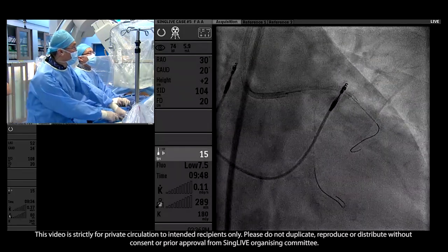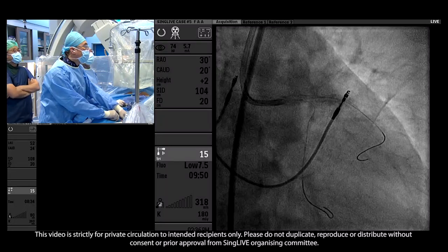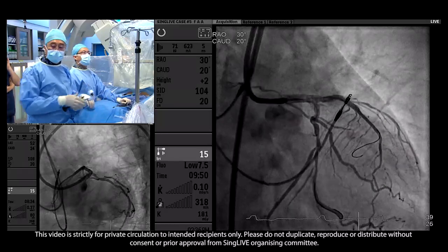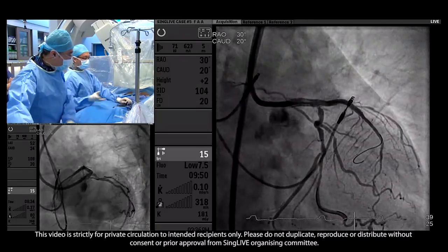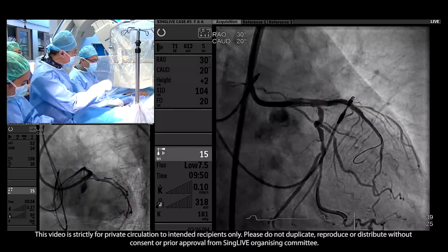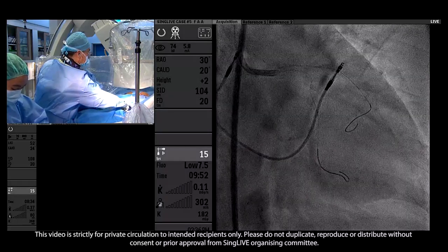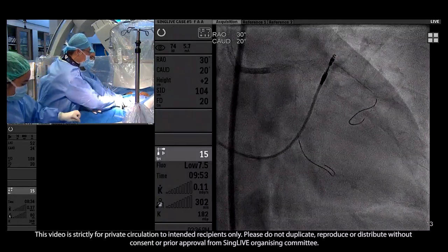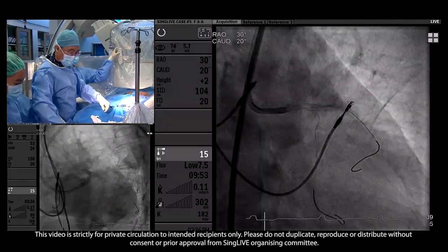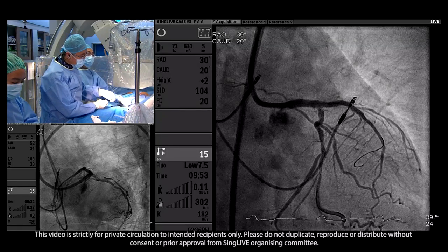It's HBR and complex, an 83-year-old female at very high bleeding risk. So it depends. But I agree that maybe I change my strategy right now because it looks like the ostial circumflex is not that bad. Maybe by putting the stent in at that time and then doing the final kissing, I will finish the procedure. And the DAPT I think is maybe 6 months, not more than that, considering she's 83 years old. Yeah, should have used Onyx. We could have gone for 1 month.